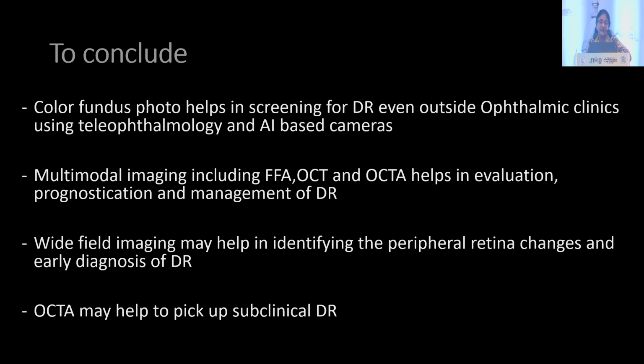Therefore, to conclude, color fundus photo helps in screening for DR even outside ophthalmic clinics using teleophthalmology and AI-based cameras. Multimodal imaging, including FFA, OCT, and OCTA, helps in evaluation, prognostication, and management of DR. Wide field imaging may help in identifying the peripheral retina changes and early diagnosis of DR. And OCTA may help us in future to pick up subclinical changes of diabetic retinopathy. Thank you so much.